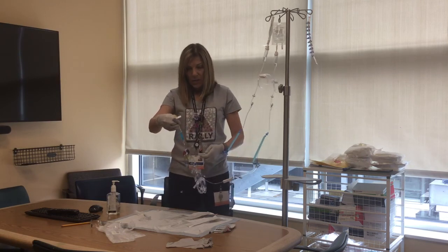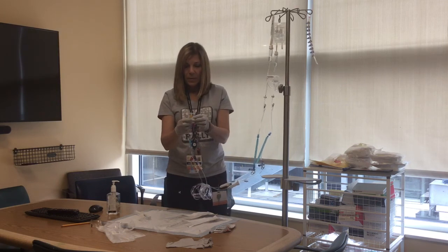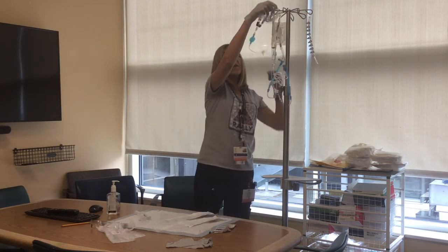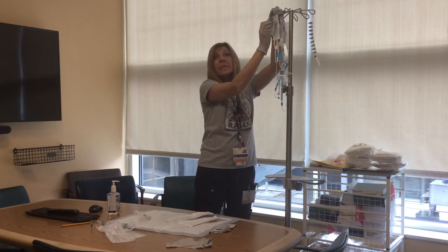And that is it. If it's drippy out the end of the cap, you can take that cap off and replace it with one of the dark blue alcohol caps. Nothing has touched the surface once you've opened it. Done.